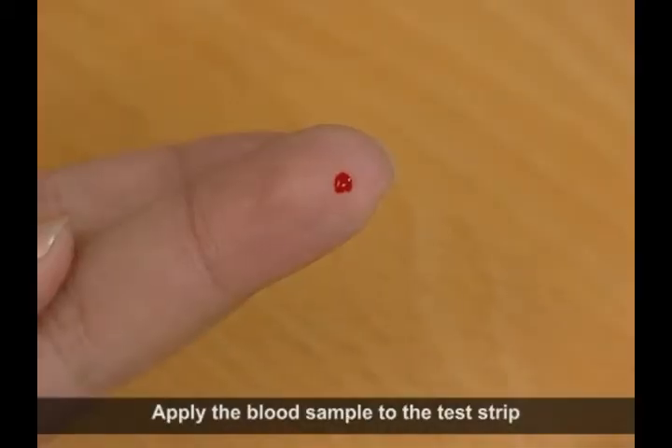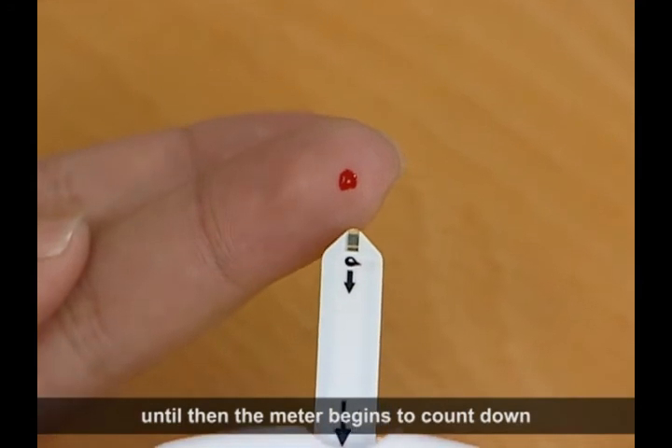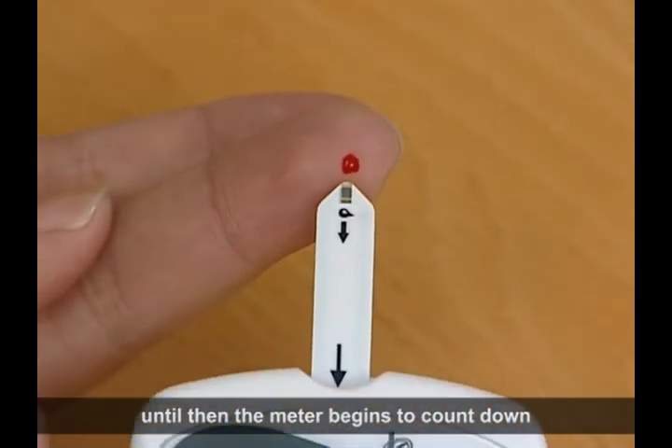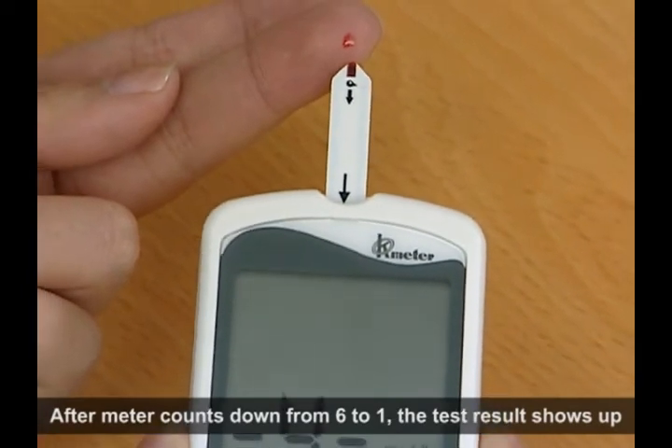Apply the blood sample to the test strip, at which point the meter begins to count down. After the meter counts down from 6 to 1, the test result shows up.